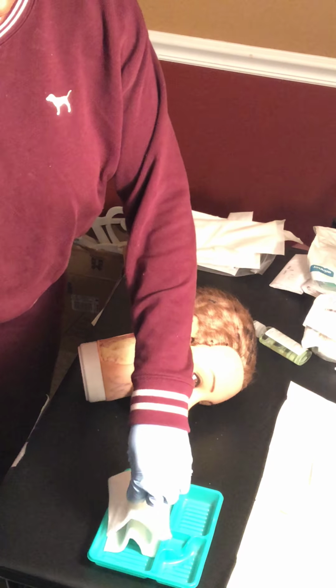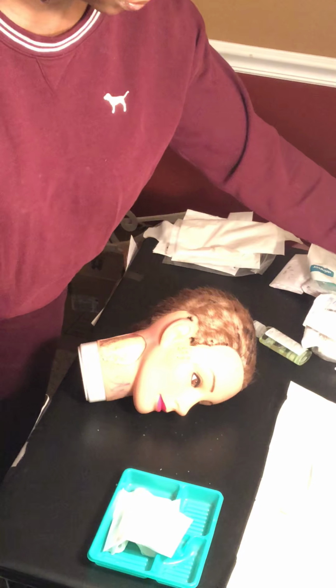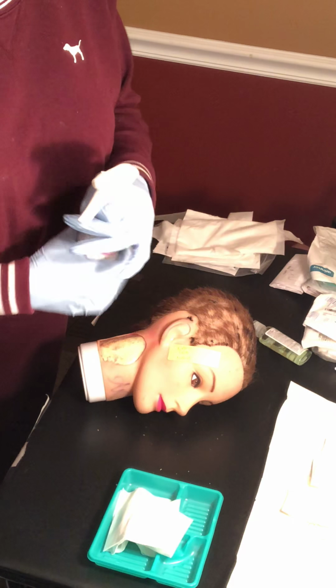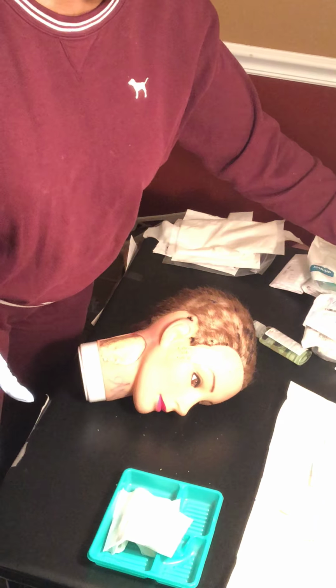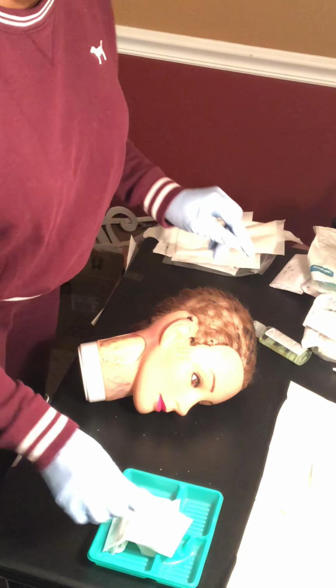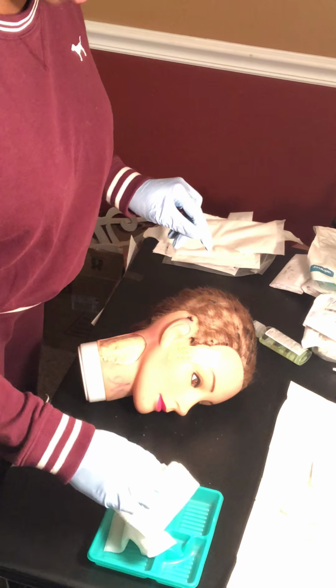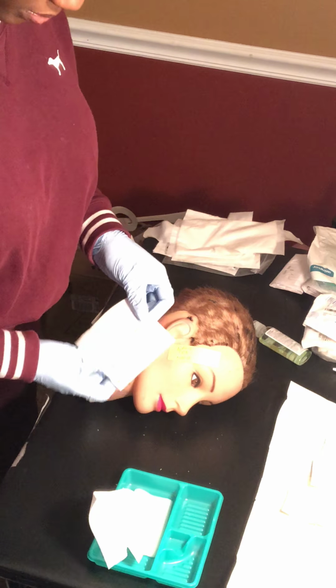So this is sterile, but I'll just pour some more on top of that. Actually, I don't have to really wet the gauzes that I'm gonna use to clean it. So it's wet.